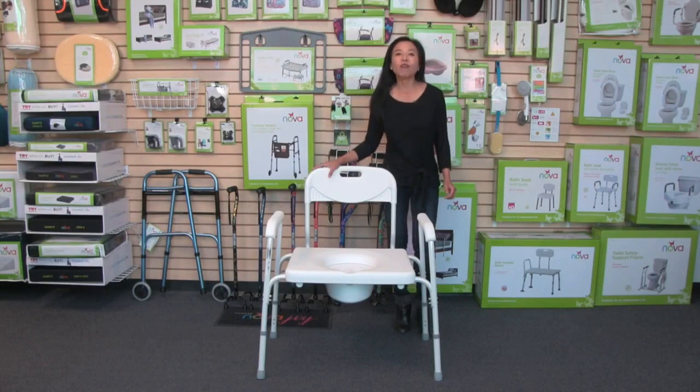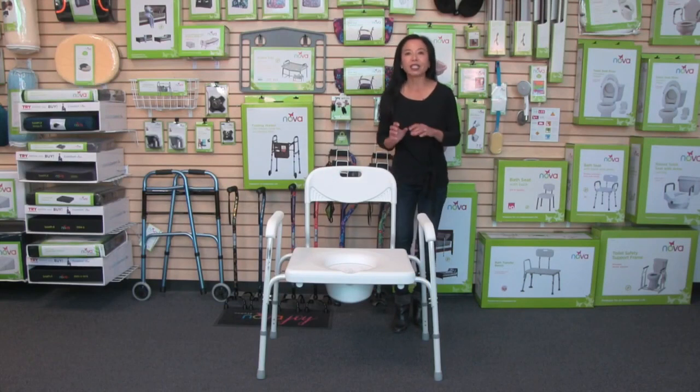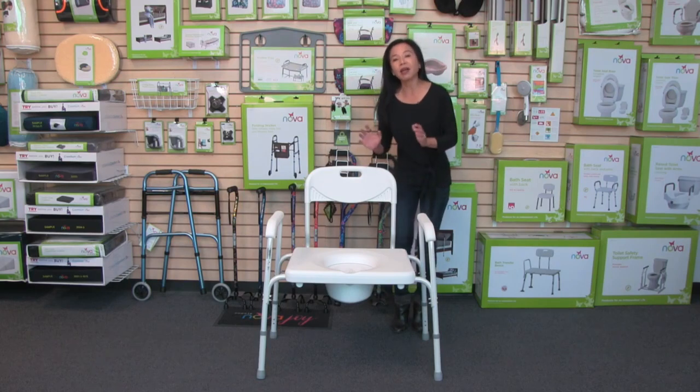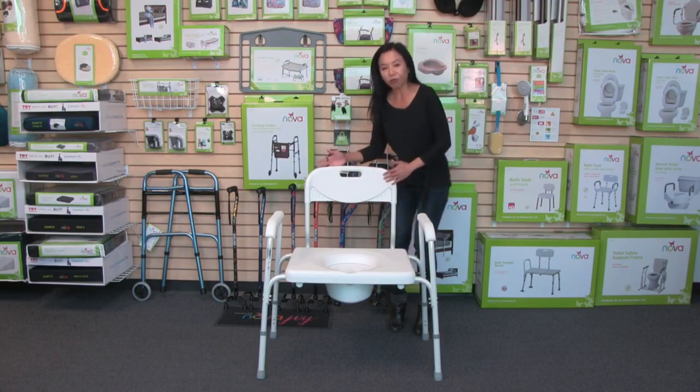Hi, this video is about the Nova heavy-duty bedside commode with a 450-pound weight capacity. This commode comes to you fully assembled — you just have to attach the backrest.